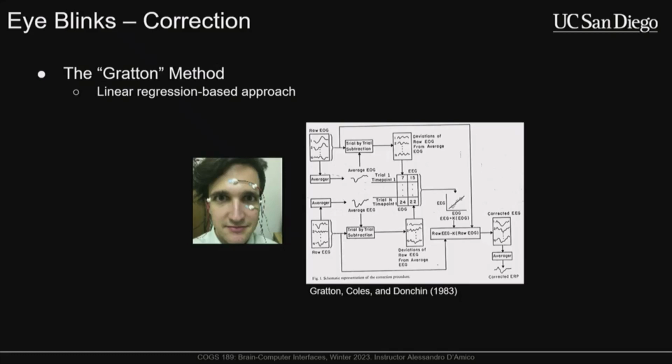It works quite well, but what you have to understand is that whenever you're doing a subtraction approach like this, you end up throwing out some of your data, even though you end up removing most of your noise. So although the EOG electrodes are picking up predominantly EOG data, this eye blink data or eye movement data, they do contain a tiny amount, a non-insignificant amount though, of EEG data as well. So when you apply the subtraction method, yes, you're trying to remove this artifactual signal, but you also will be removing some of your data.